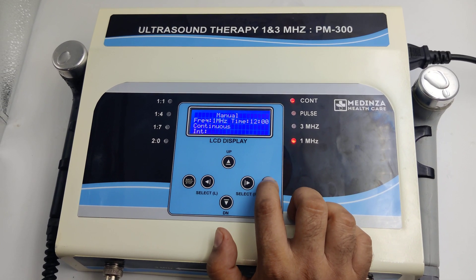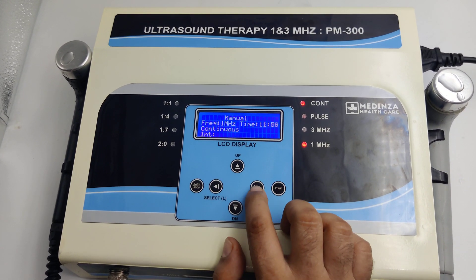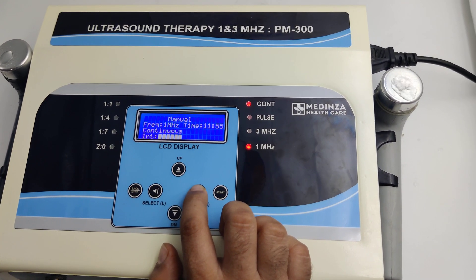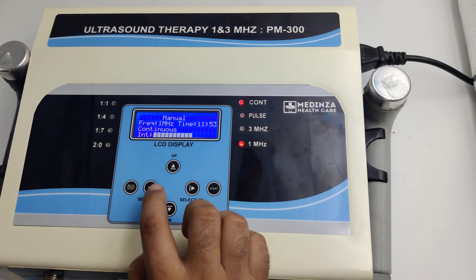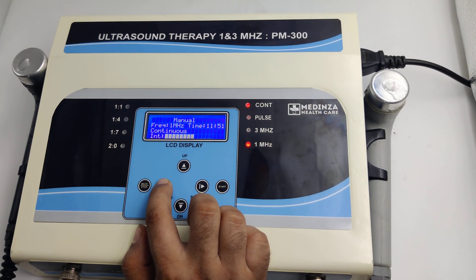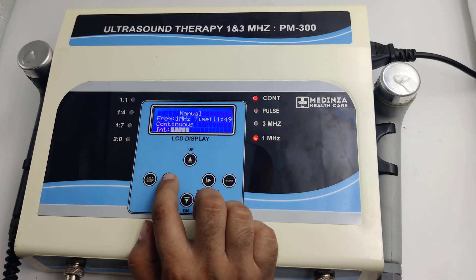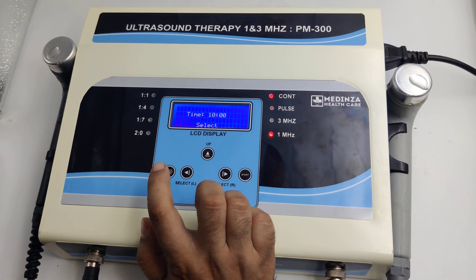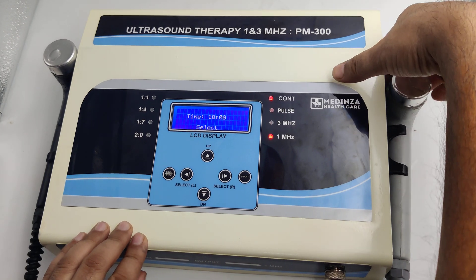Start the manual program. Increase the intensity and decrease the intensity as needed. After the treatment, stop the machine and switch off.